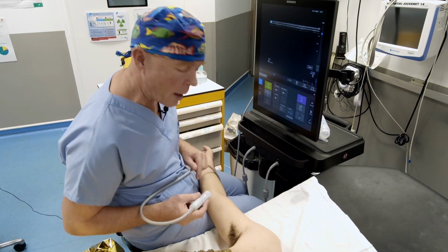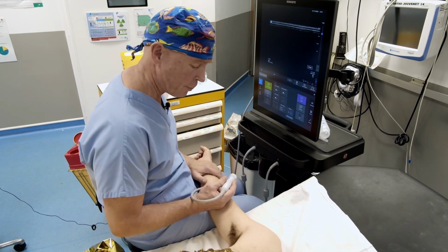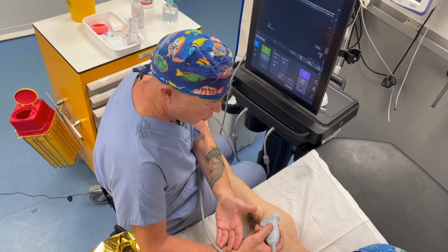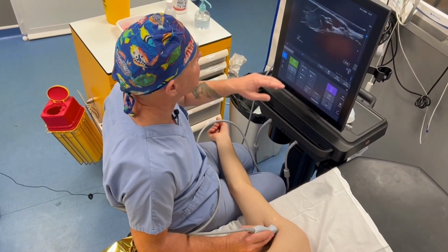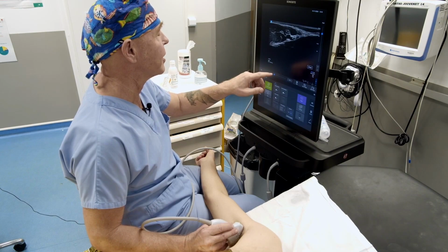So let's start with the axillary block. As you can see, I position myself like this. I take the patient's arm a little onto myself. My right hand is stable and fixed, slightly stabilized on the wrist so as not to move my image. And I start to scan and follow. Here we see a slight anatomical variation, but it more or less matches up. So to be a bit more didactic, we'll do it this way.